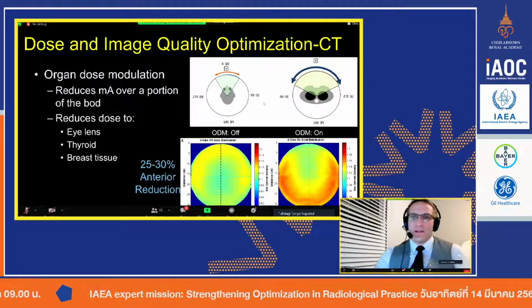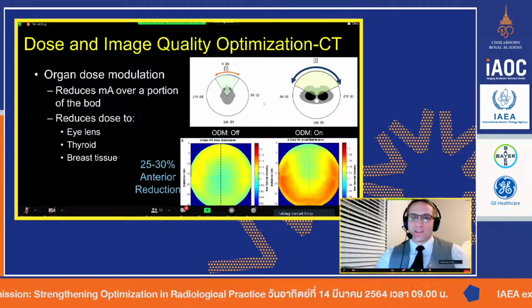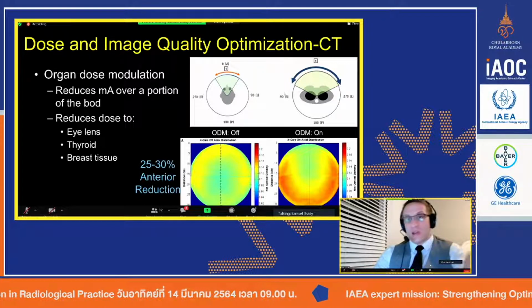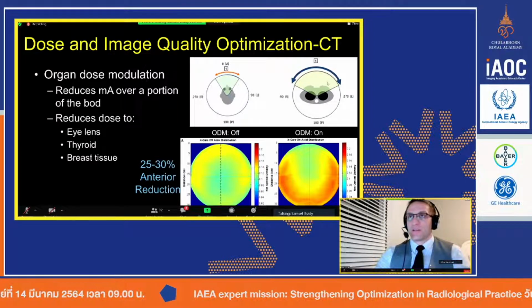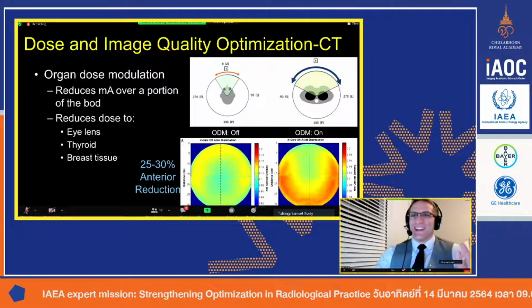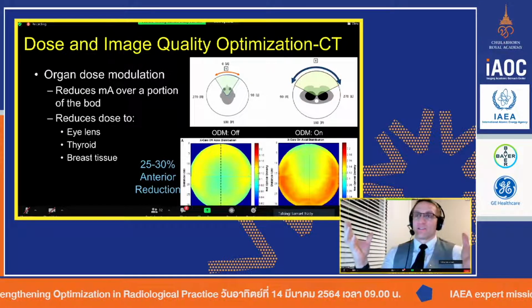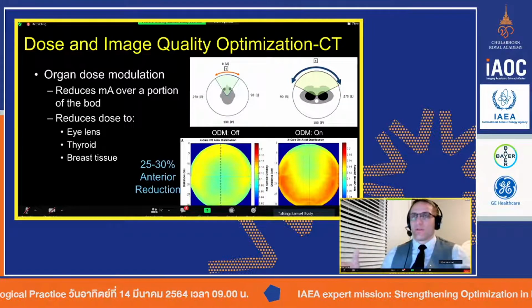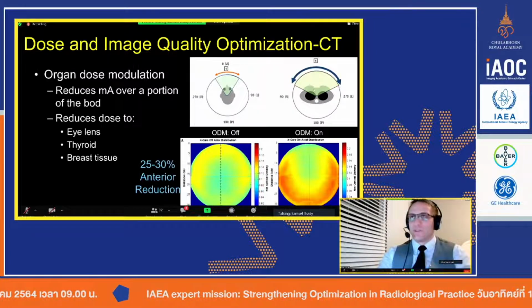This is going to lead to the second question, for the pregnant woman or has a fetus that needs a CT exam. And so the answer is, yeah, you can turn this on as it sweeps over anteriorly. The answer is yes, you are going to reduce the mA to that point. Obviously, the question is, where is the baby? If it's a second or third or late trimester, it's a late trimester pregnancy, then the baby may not fully fit within this field of view.